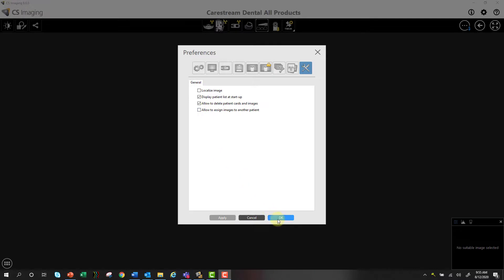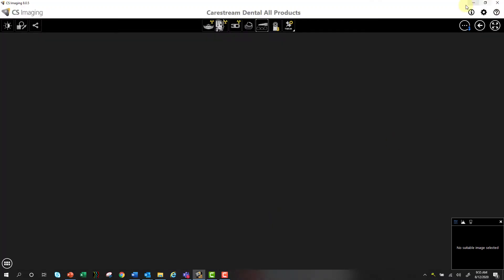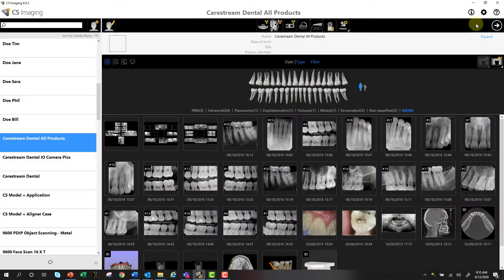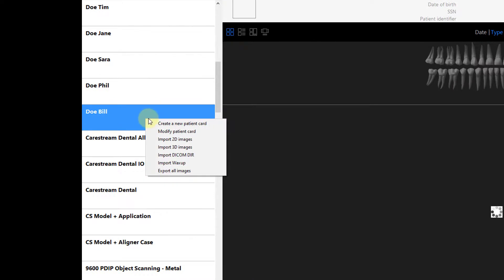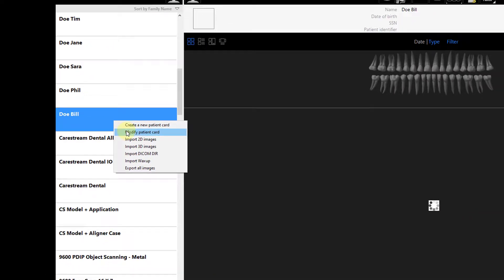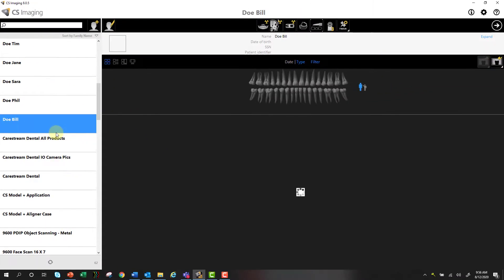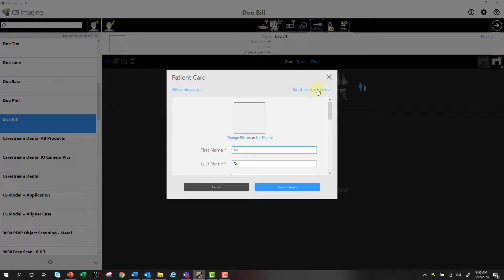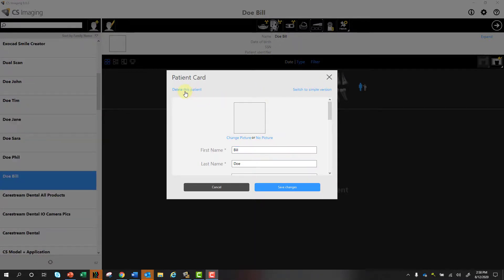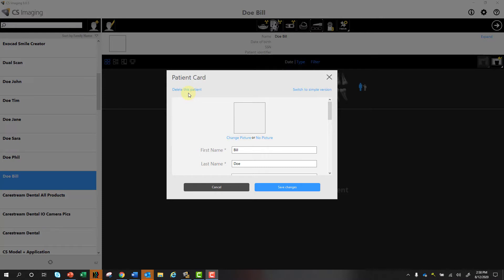And you'll be able to delete an entire patient card, which I'll show you that really quickly too. I'll just exit out of this, go back to my browser, and I can right-click on a patient and say modify patient card. And if I say switch to full version, I can now delete the entire patient. Keep in mind the editing or deleting your patient card or your actual patient is really only done in your standalone CSI 8. In other words, if you're connected to practice management software, that's not really going to be an option.